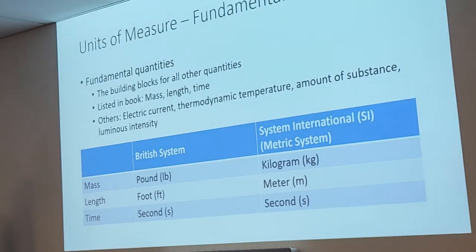Yes, Emily? We don't have dosimeters yet. Correct, we still don't have dosimeters. They're still on the way. Oh, okay. So we'll just stay behind some more. Yes, just take your normal precautions. You should never be in the room while an X-ray is going off. Or don't be in clear line of sight of the tube. Always be behind a window or something like that when the X-ray goes off.